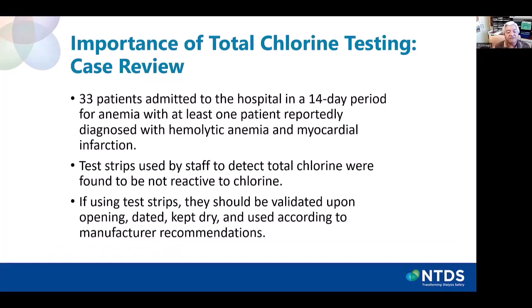A component failure is not the only issue that can make dialysis water unsafe. In this case review, 33 patients were admitted to the hospital in a 14-day period for anemia, with at least one patient reportedly diagnosed with hemolytic anemia, and a myocardial infarction occurred. The test strips used by staff to detect total chlorine were found to be not reactive to chlorine. If using test strips, they should be validated upon opening, dated, kept dry, and used according to the manufacturer's recommendations. Most strips require quality control validations, and surveyors will review the quality control practice for the use of the test strips as part of their survey.